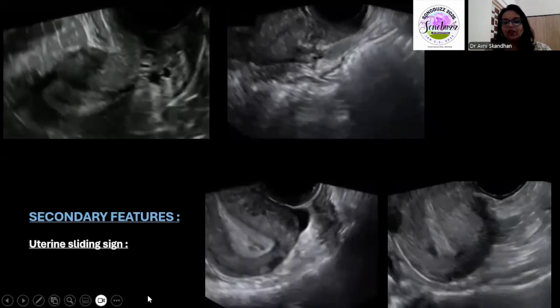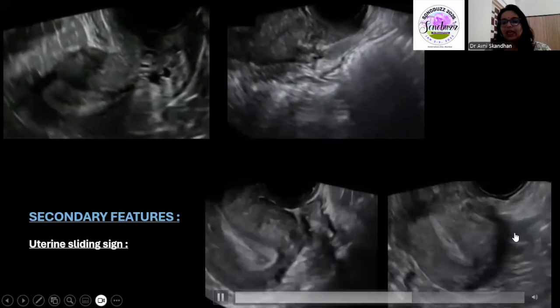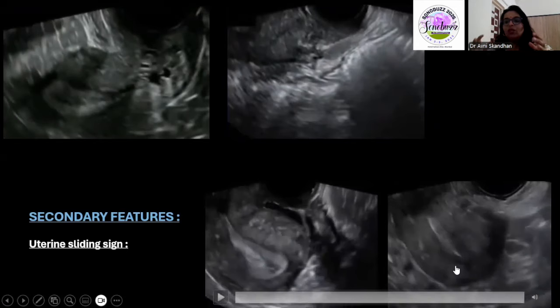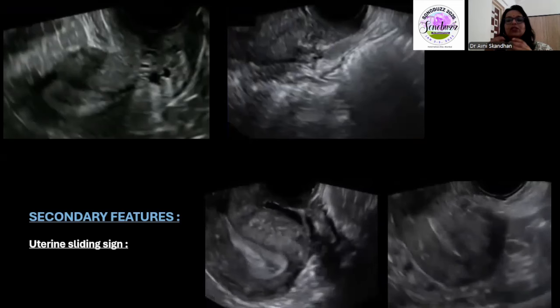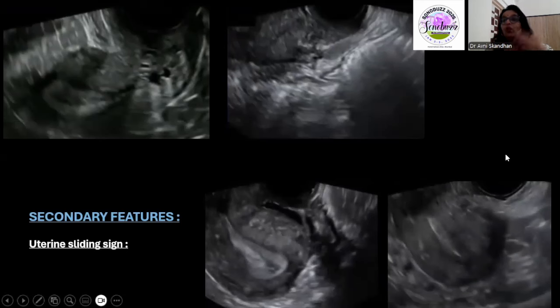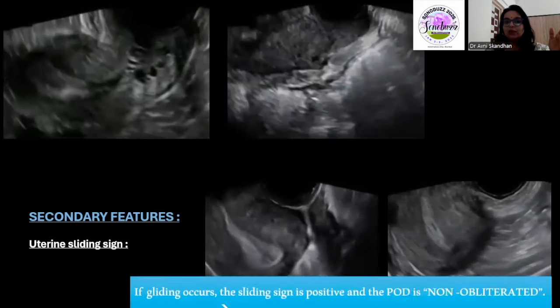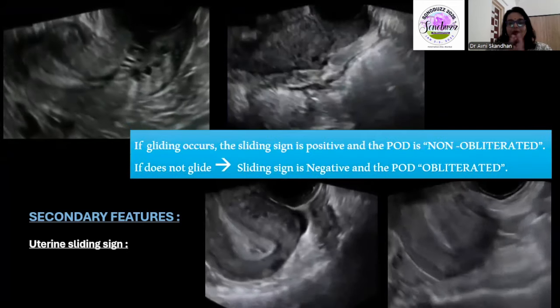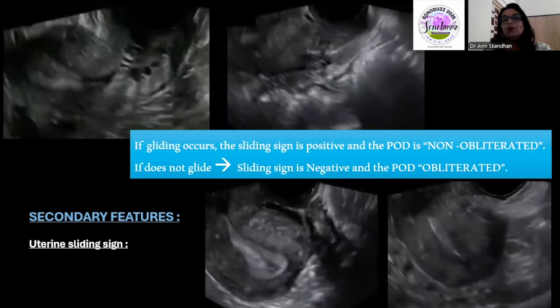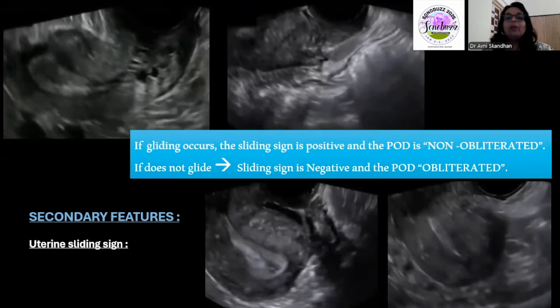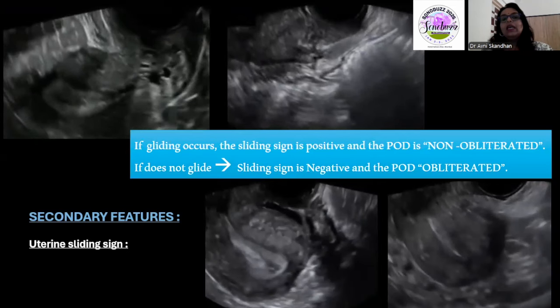This is how it would appear in a retroverted uterus — you see pressure causing movement, but structures are not moving against each other. If you see this kind of finding, you must mention in your report whether uterine sliding is present or not. If sliding is present, state that the POD is not obliterated. If you do not see uterine sliding, state that the sliding sign is negative and the POD is obliterated.